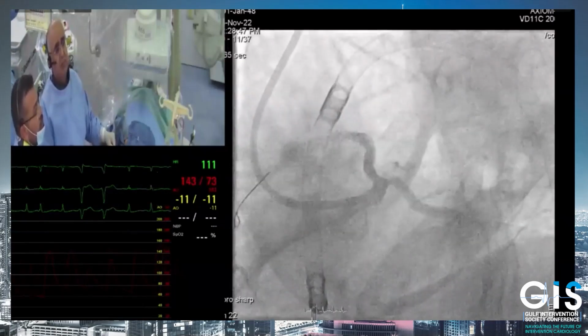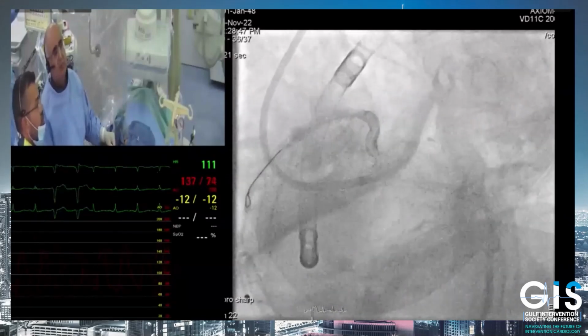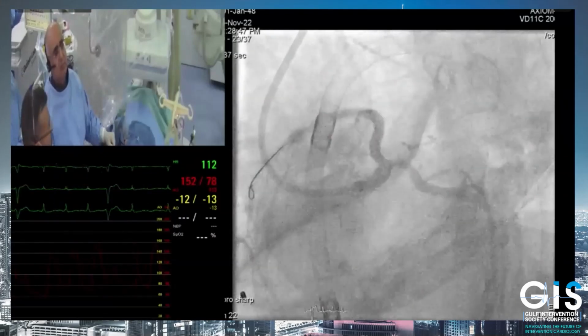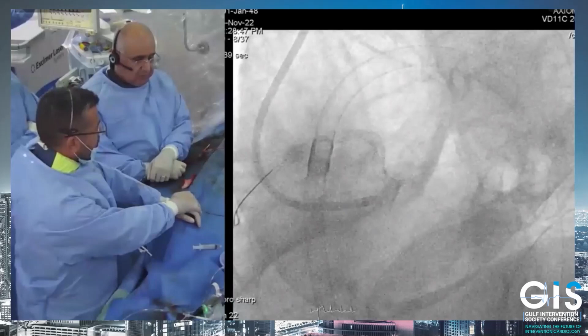The comment I want to make is about the mid-LAD. I think we're trying to curtail what we do. The exit of the stent and the distal flow is a huge determinant of the long-term outcome, and I think this is what Gabrielle was trying to allude to. And I think it will not hurt. It will not take too much work, at low pressure with a non-compliant balloon, just to open the flow distally.